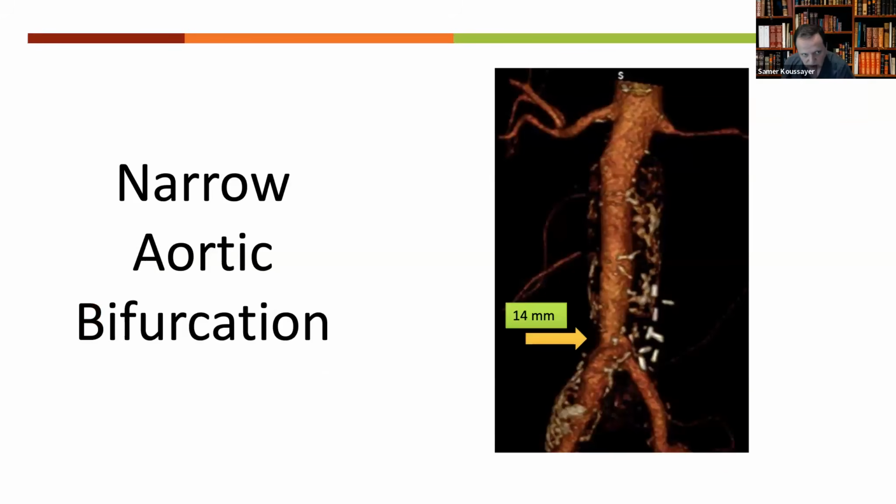Okay, before we go to the neoaorta, any question about any problem with the neck? So we're done with all the problems with the neck. Any question? No question. Okay. The second challenge: we talked about the neck, now we go to the bifurcation.